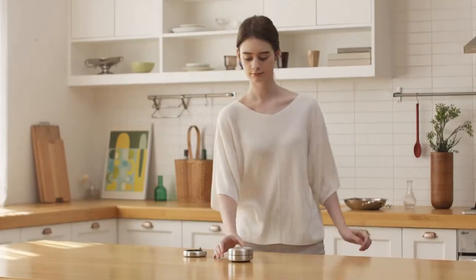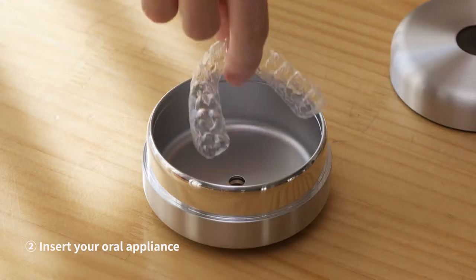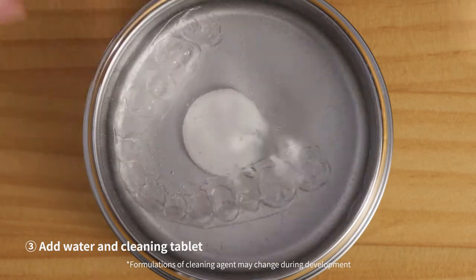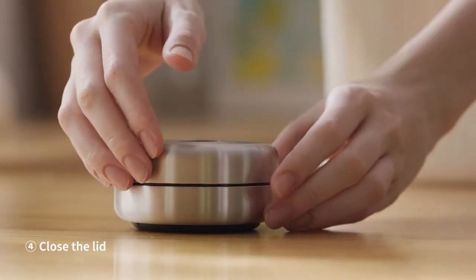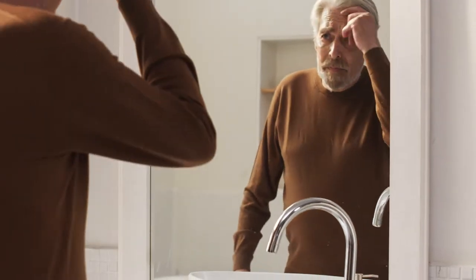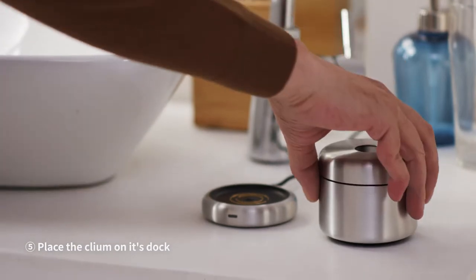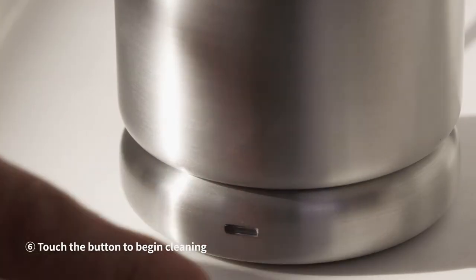Cleaning with the Cleam is simple. Take off the lid. Insert your oral appliance. Add water and the Cleam cleaning tablet. Then close the lid. Next, place the Cleam on its dock and touch the button to begin cleaning.